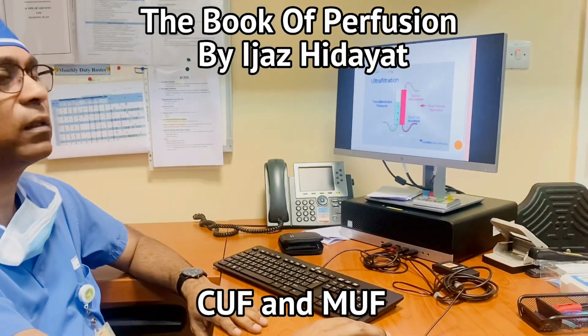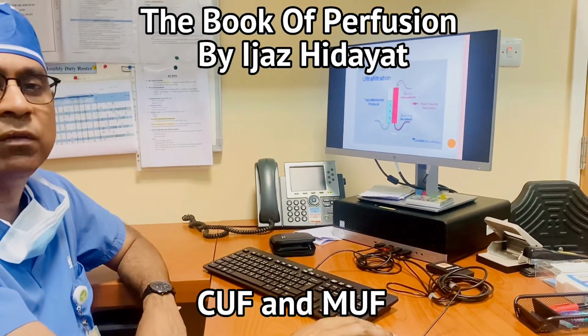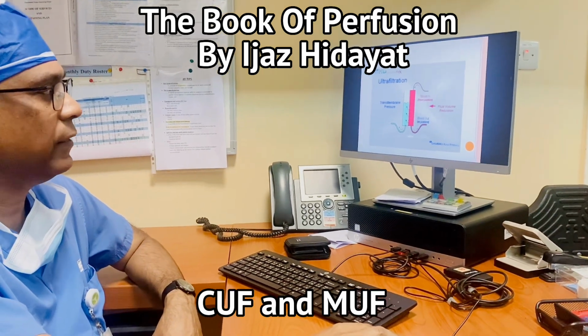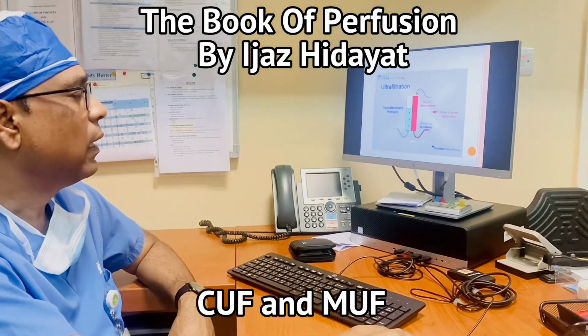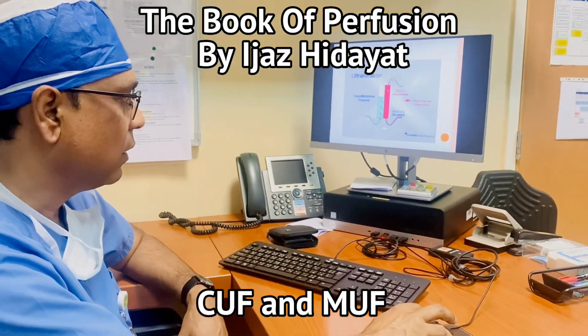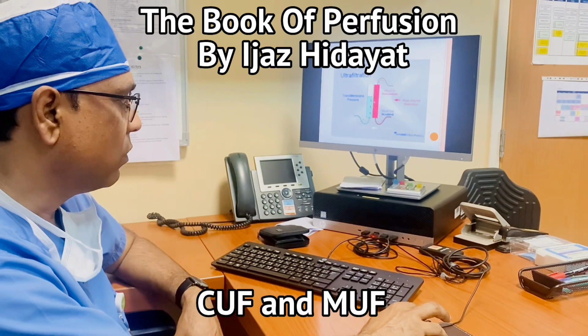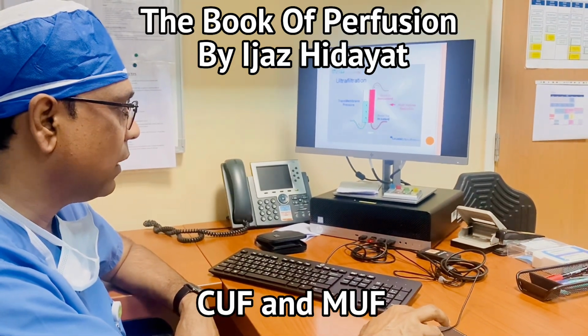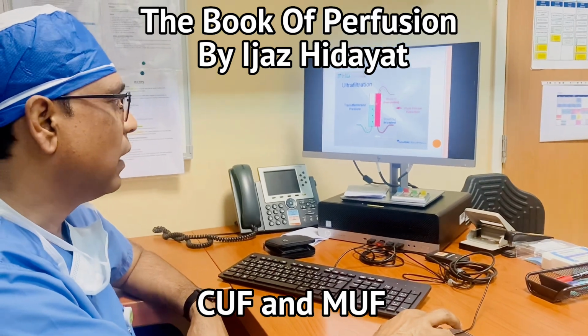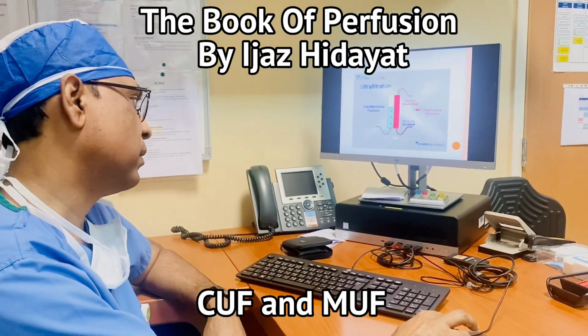Can you show this diagram to my viewers? This is the diagram of ultrafiltration. Normally blood enters the hemoconcentrator through this path and goes along the membrane, and this is the outer layer. So there are two chambers here, from higher concentration to lower concentration.